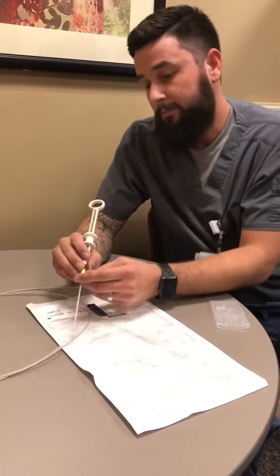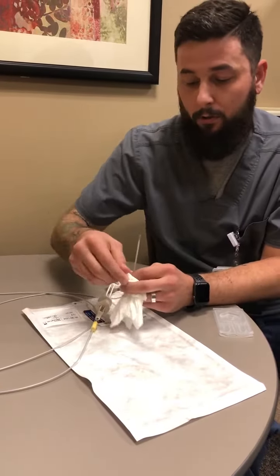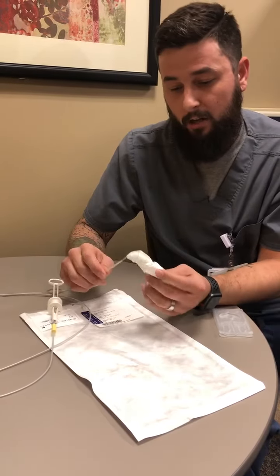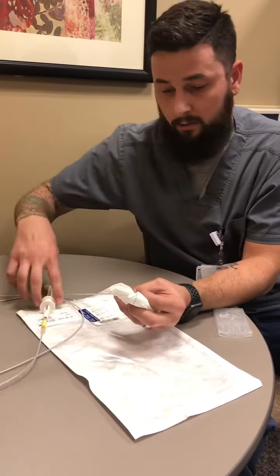Once that is out, you will lasso your polyp to the stalk — this will be our stalk. The doctor, once they are ready, will tell you to start closing on the polyp.